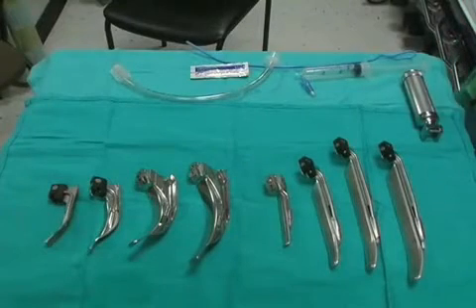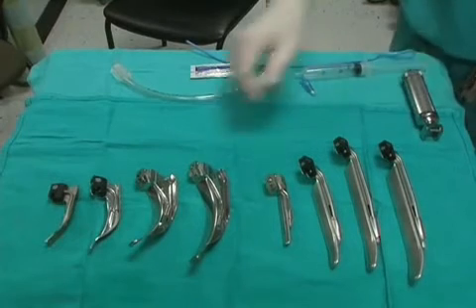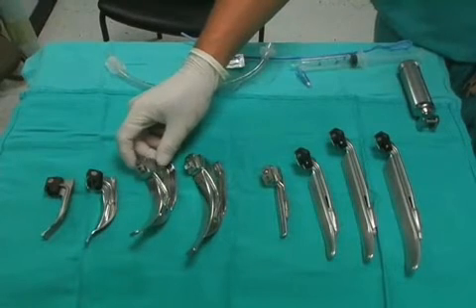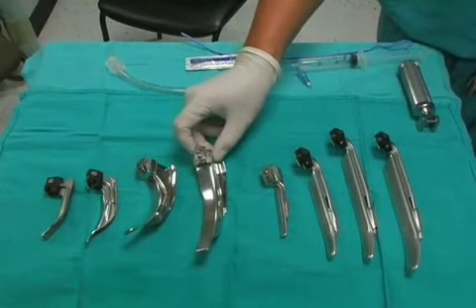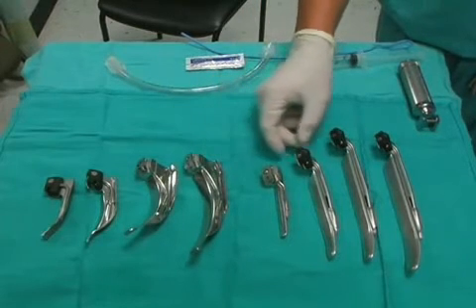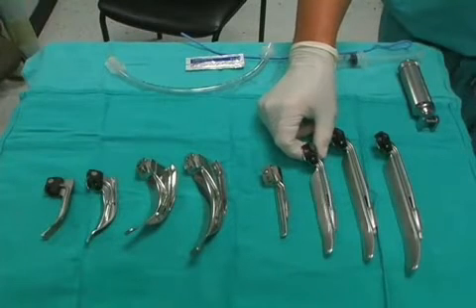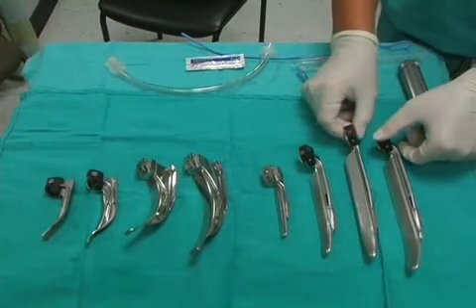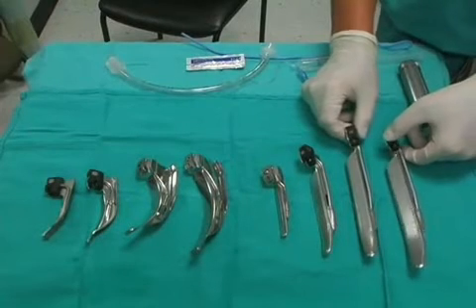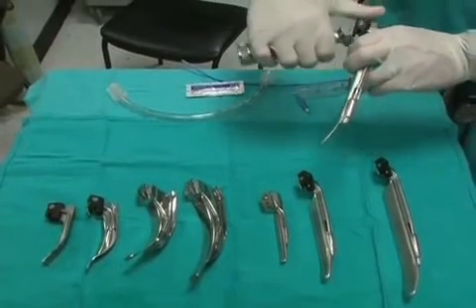The blade type and size should be selected. If the operator prefers to use a curved blade, a number 3 blade for a smaller individual, or a number 4 blade for a larger individual may be utilized. If the operator prefers to use a straight blade, a number 2 blade can be selected for a smaller individual, or a number 3 or a 4 straight blade may be selected for the larger individual. Once the blade has been selected, the light on the blade should be tested.